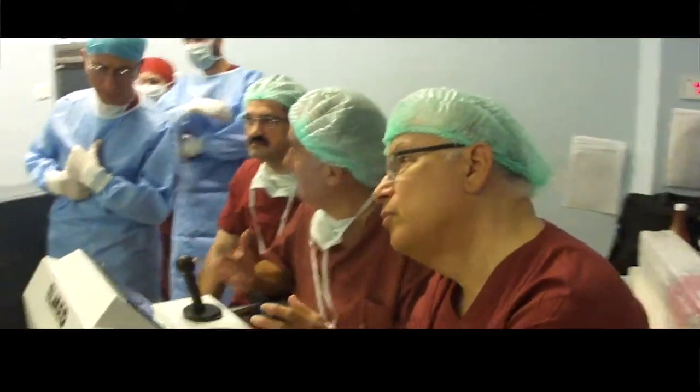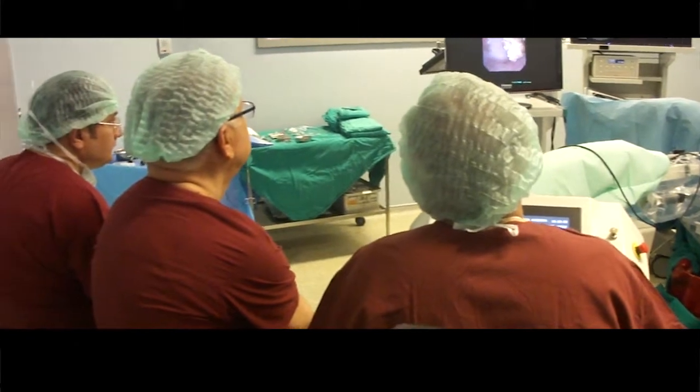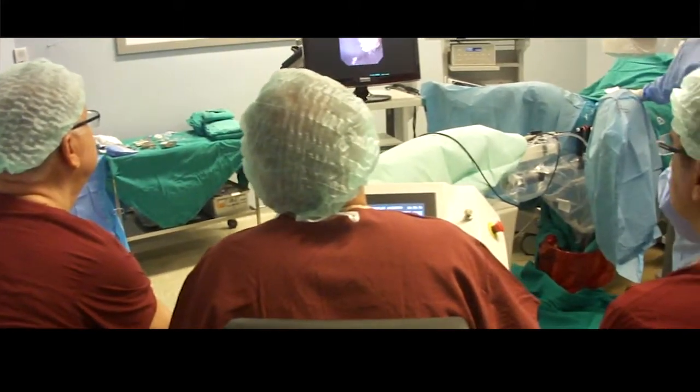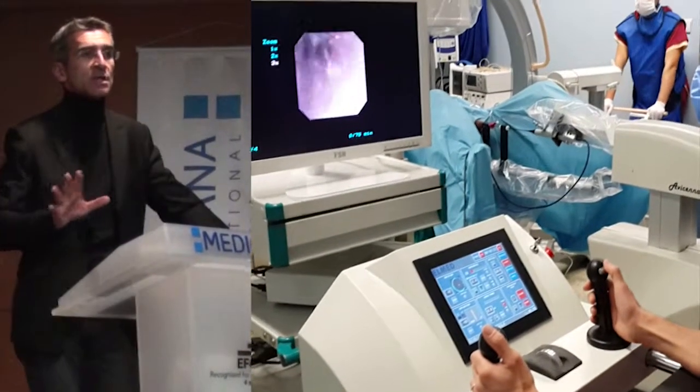Experts in flexible ureteroscopy from Germany, France, and the United States have come to Turkey to perform robotic flexible ureteroscopy. The future is robotization.